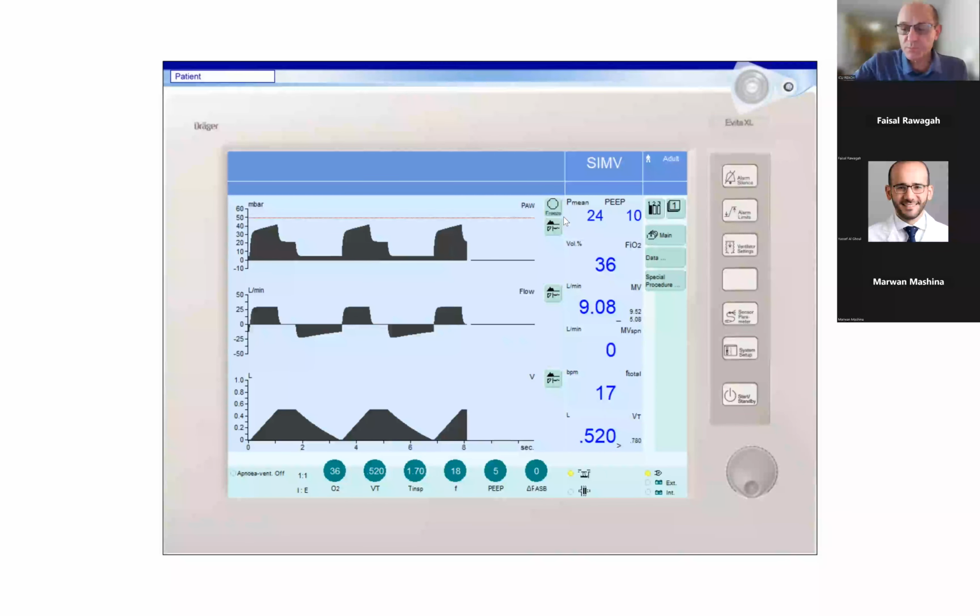So first, of course, we can treat the obstruction in the patient, using inhalers with bronchodilators. Okay, so you have bronchodilators, you have steroids on board, but we need the ventilatory management here. Okay, so ventilatory management. So patient is auto-PEEPing. So one thing we can do is increase his expiratory time. And I can see we are not using the whole inspiratory time to give the volume that we need to the patient. So we can decrease his inspiratory time and add that to the expiratory time. Okay, tell me what you want to do on the ventilator.